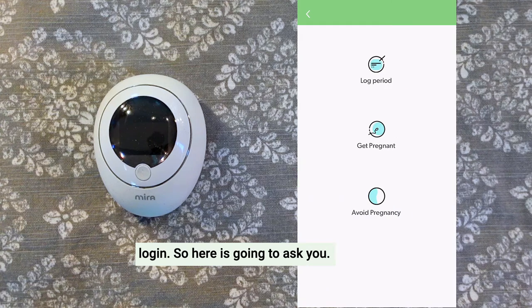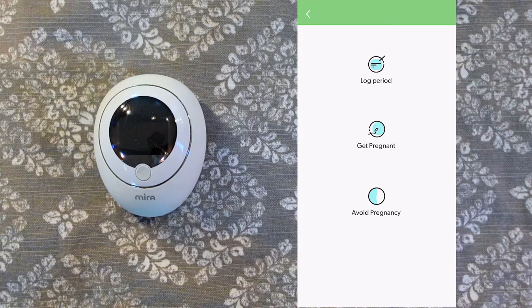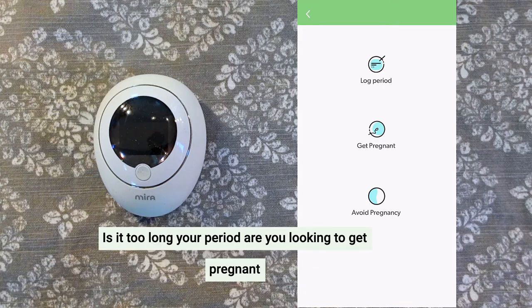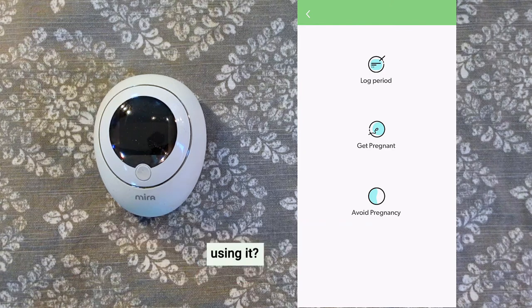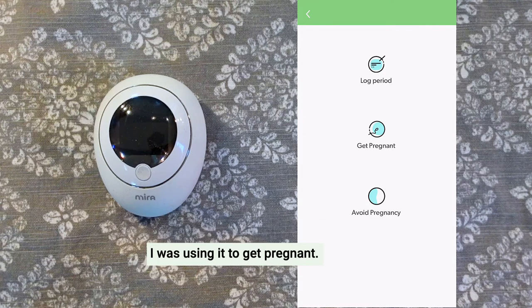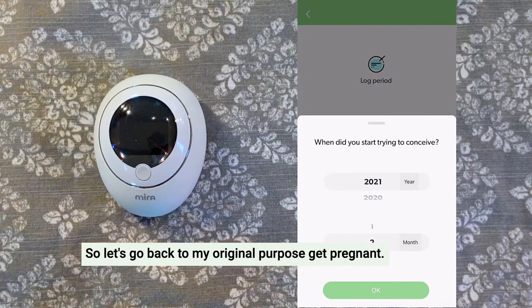The app is going to ask you, what are your goals? Is it to track your period? Are you looking to get pregnant? Are you looking to avoid pregnancy? At the time when I was using it, I was using it to get pregnant. So for the purpose of this video, let's go ahead and select get pregnant.